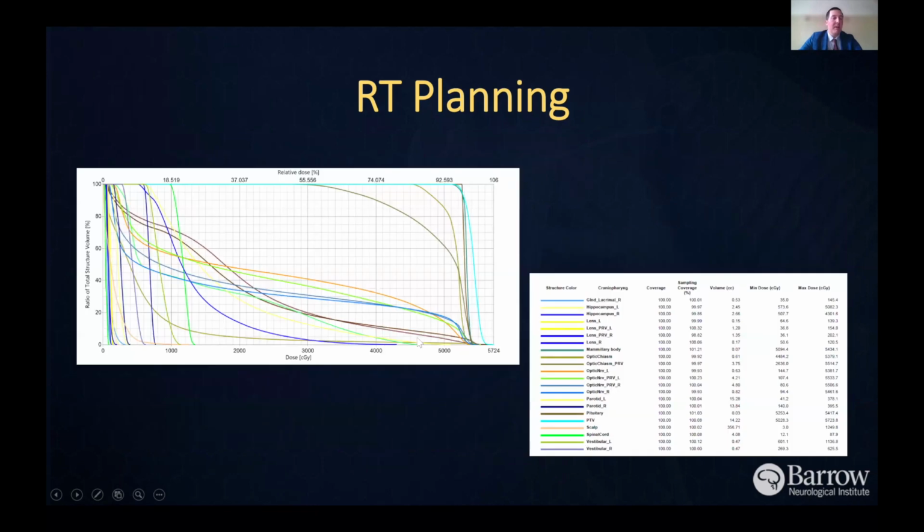Just a little bit in the background. Using computer software, we're able to calculate the exact doses of radiation to tumors and to the normal organs to ensure we've created the safest plan possible. And sometimes we have to go through many, many iterations of this in the background. It's only after all these safety checks are met that we actually start the radiation plan. So that's why it takes some time between doing the actual planning and delivery of treatment.